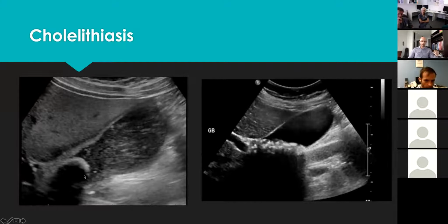And this is an important thing. I talk about it in more detail in the slides that are coming. The shadow of it, as you can see, is a clean shadow, because we have two kinds of shadows in the abdominal exam, the dirty shadow and the clean shadow. The clean shadow is when you technically don't see anything after it. And you can see here a clean shadow as well.